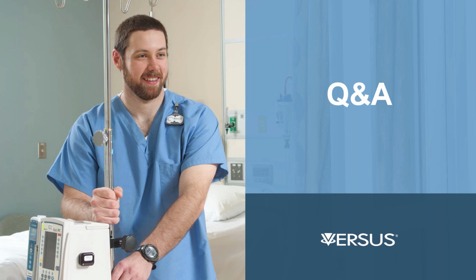What I think really helps, as a former customer in a hospital setting, was tying anything we did around locating people directly to patient care. Oftentimes RTLS is a value add to a nurse call system, and that integration allows some passive functionality. Say there's a call from a patient, the nurse is wearing some sort of locator, walks into the room, and by just being present, cancels the call. So there's a positive ROI specific to that caregiver at the bedside just by wearing the locator.